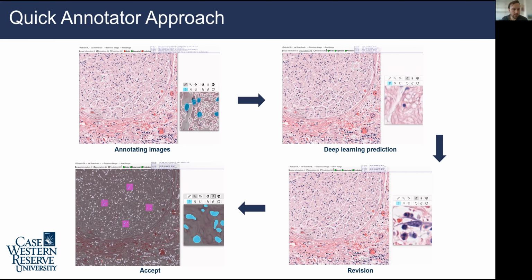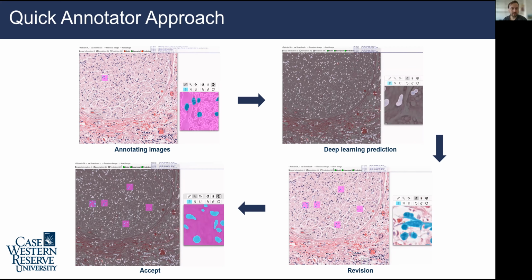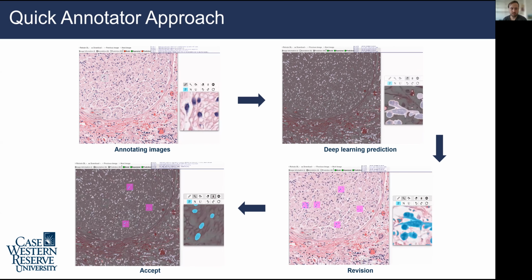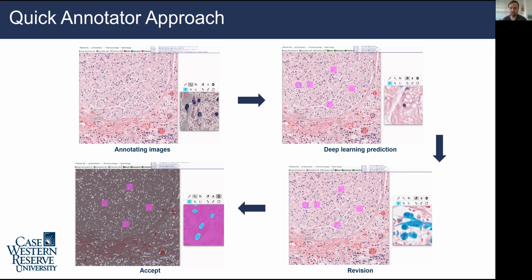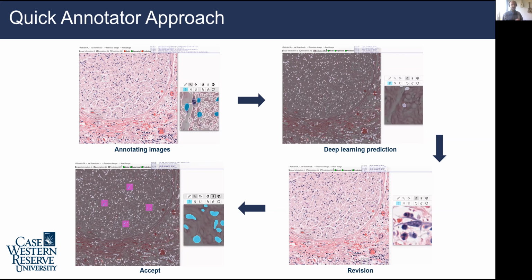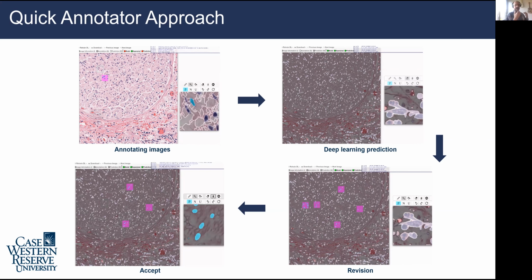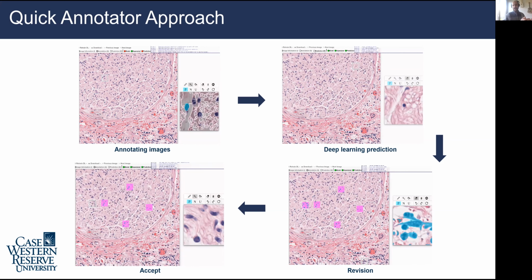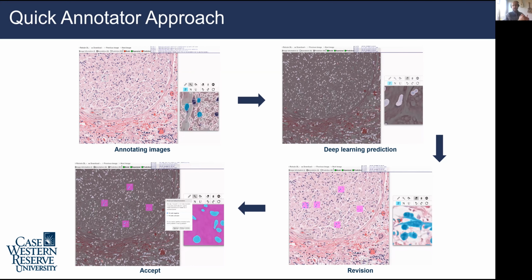Good. We have one more question. Once the annotations are performed, these can be saved and then used on untrained images if these are similar images. Is that correct? Yeah, so that's a great question. We really designed this to be as user-friendly as possible. And if you look in the output directory, in the project directory, there's actually a folder called masks, which are already PNG images that are binary masks. So you don't even have to do the export process.